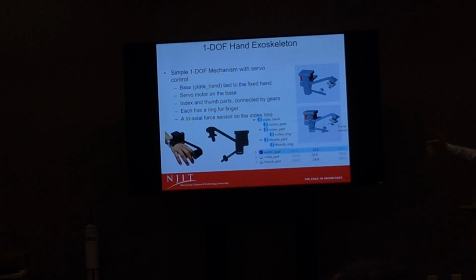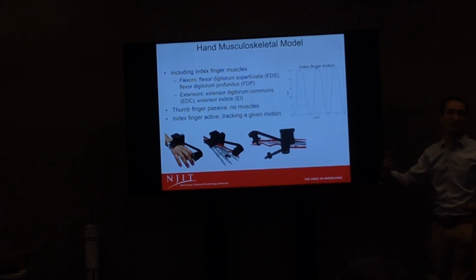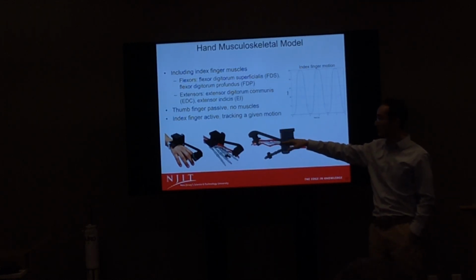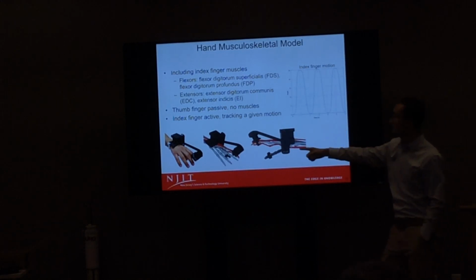We can model this robotics, and then we also model the human. I don't want to go into too much detail. Basically, I want to present some of the capability, what kind of things we can do. If you're interested, we can definitely talk. We model the human and we model the robotic, and the approach is similar. It's a robotics approach. Human joints are not too complicated, just hinge joints, similar to robotics, except you have muscles. But the key thing is that it's difficult to model the interaction between them. Now we have a force sensor here.